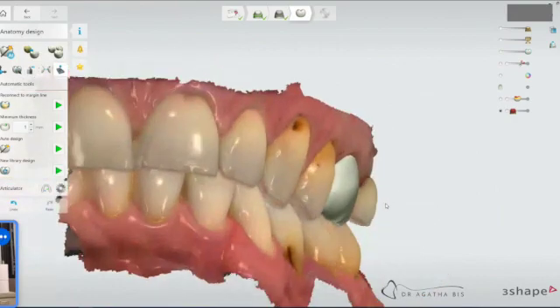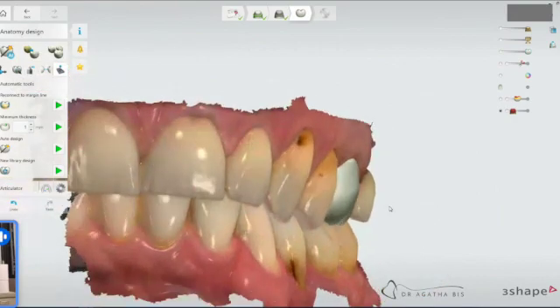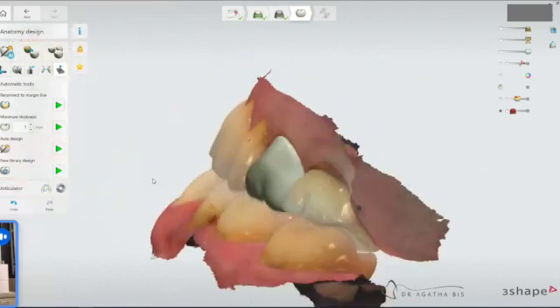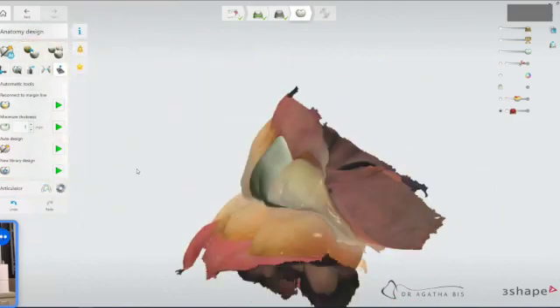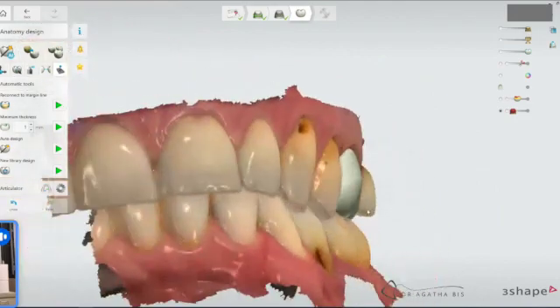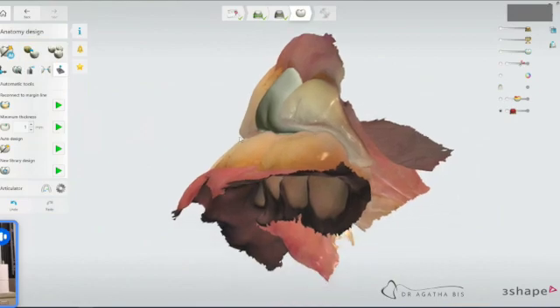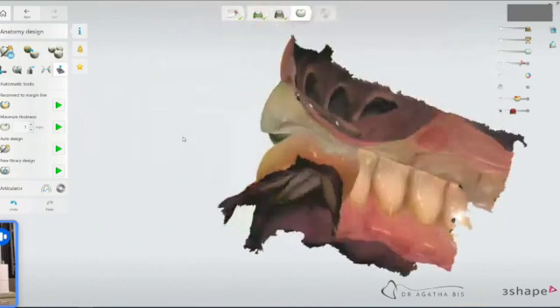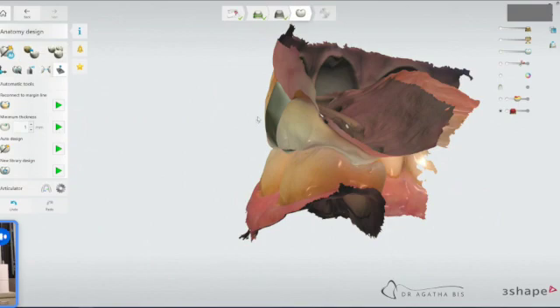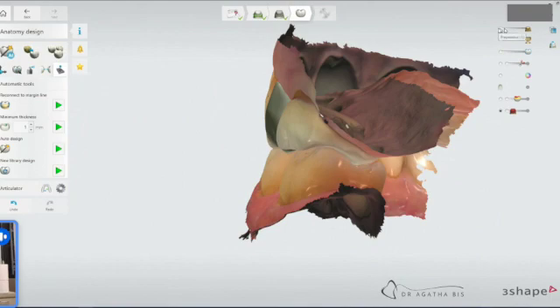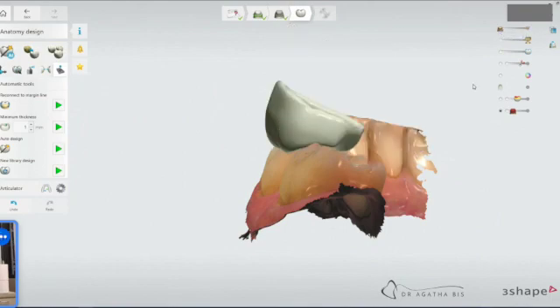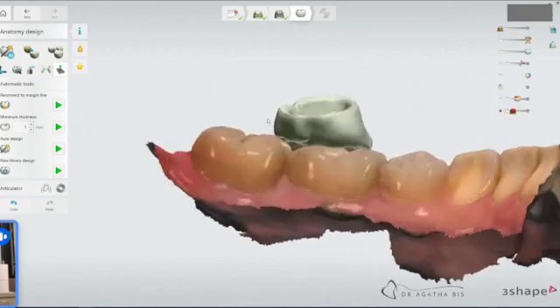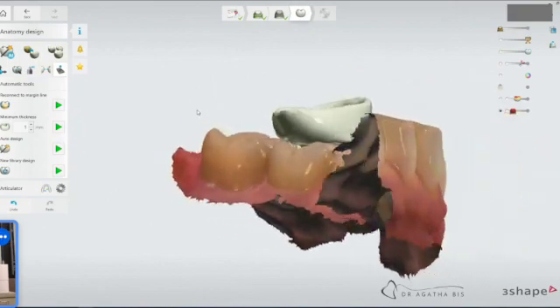I find this tooth is pretty well aligned. It might be a little bit too buccal. Let's take a look. This is one thing that I find works really well in terms of how to position this tooth. What I actually will do is eliminate the adjacent teeth. I want to see how the crown presents against the opposing arch. We're going to eliminate the other teeth.